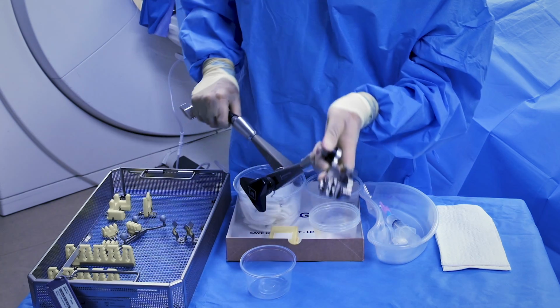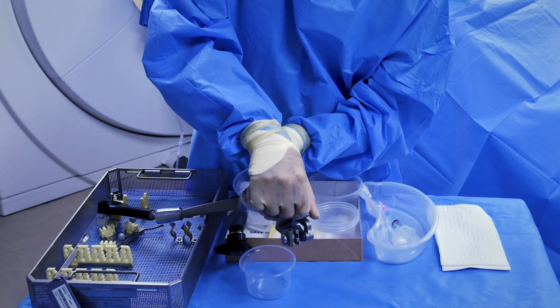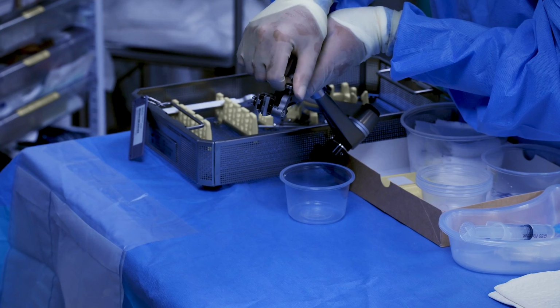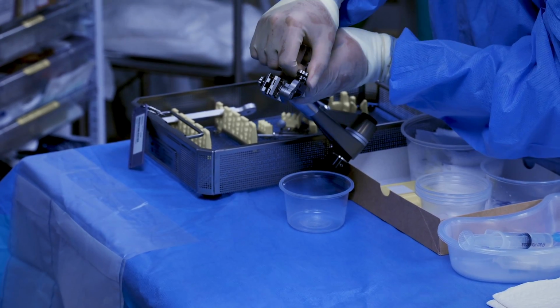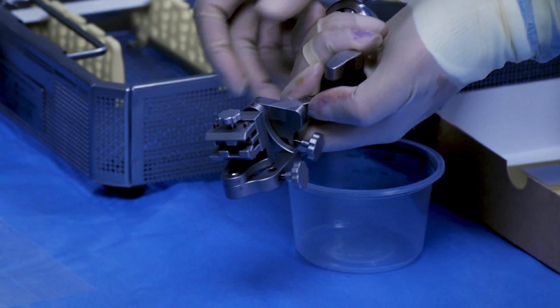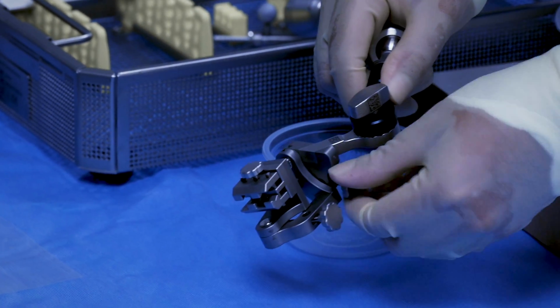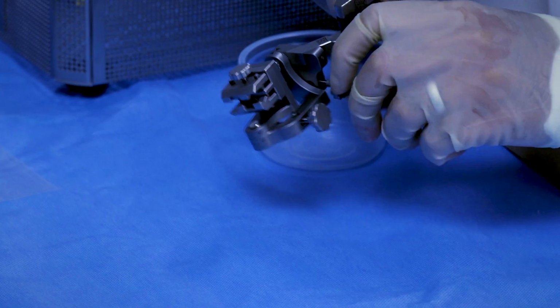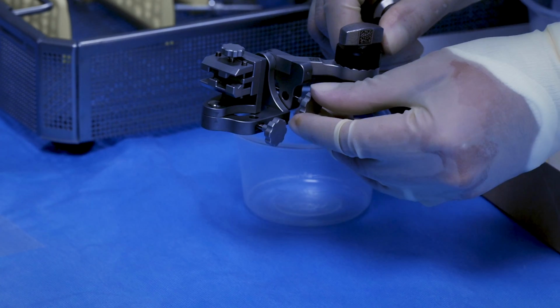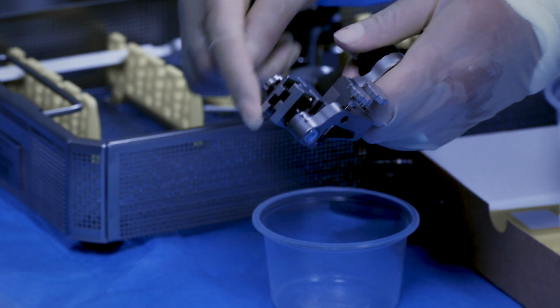And we can see the arrows on these, and these need to be aligned so that the trajectory is kind of zeroed, so we're able to adjust that from a consistent starting position. And there's a further set of arrows here, which is controlled by this one, and once again these also need to be aligned, which they are now. So this is where the needle and aiming device is going to go in here.